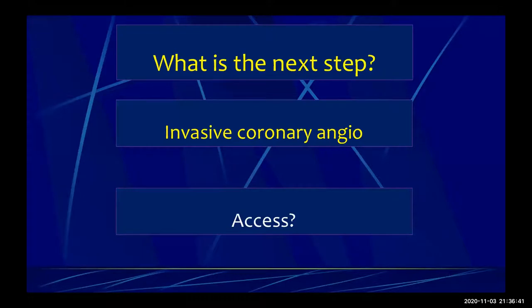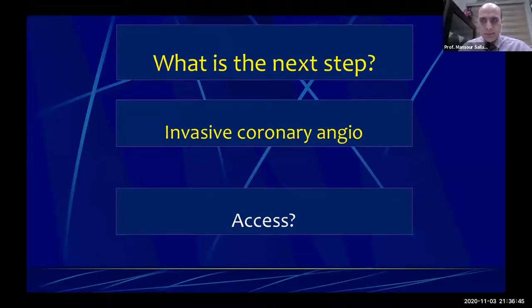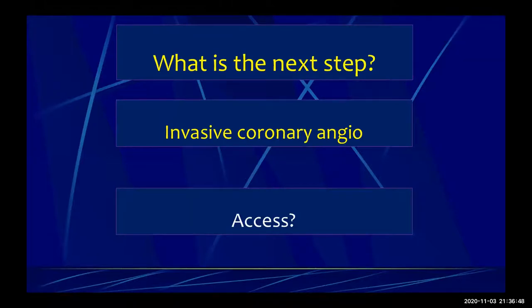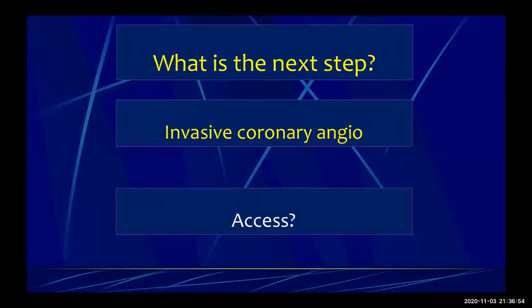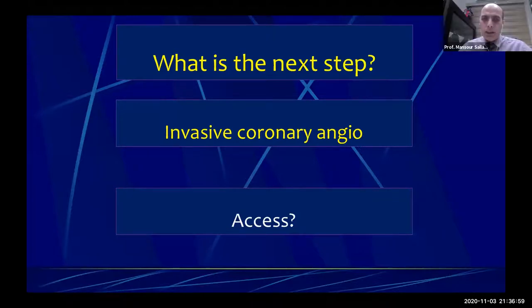Okay, for this case, I think the access for you is radial. This is my comment. Right or left? No, but I think I am obligated right now. I have a LIMA right now. Okay, it's the left side for sure. So for sure, it's the left side. I think it's the most preferred.